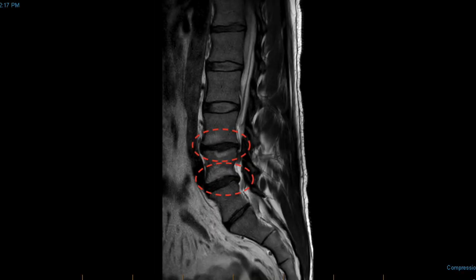In patients who have multi-level degenerate pathologies, we can also offer appropriate surgical solutions such as hybrid solutions, where an artificial disc can be placed at one level and a cage with a fusion core can be placed at the adjacent level. This is an intraoperative x-ray of such a hybrid procedure where the mobile disc has been placed at L4-5 and the cage with a fusion core has been placed at L5-S1.